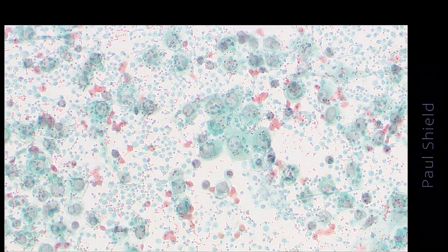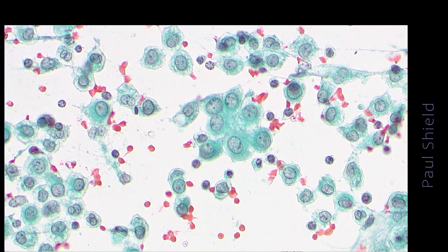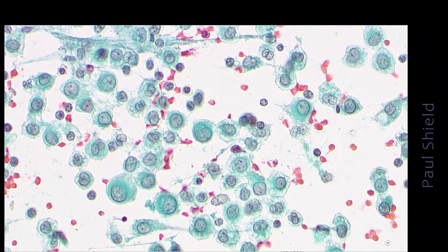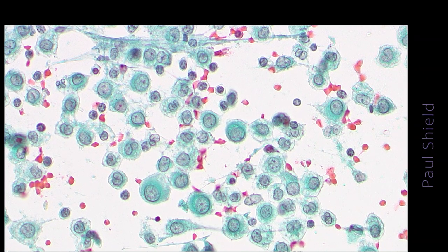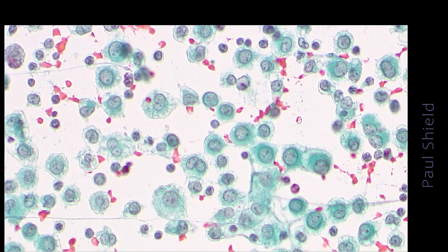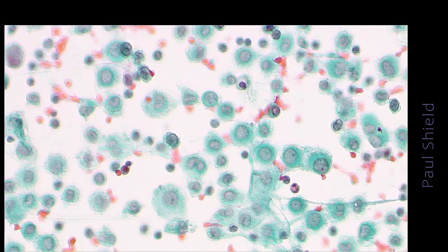This is the Pap stain. You can see it's very cellular, lots of mesothelial cells and some little groups. But even at this power, you can see how pale the nuclei are, so they're just not standing out from the cytoplasm. They've got prominent nucleoli, but they're quite identifiable as definitely mesothelial cells. Just looking around, they've nearly all got lacy collars like this.